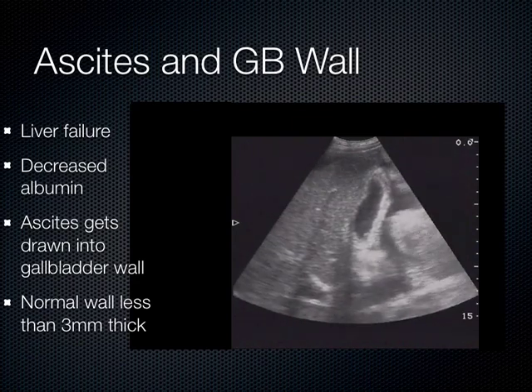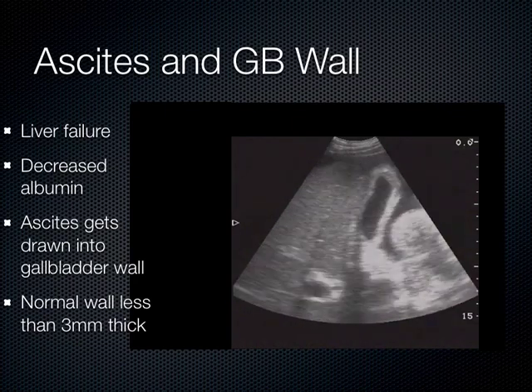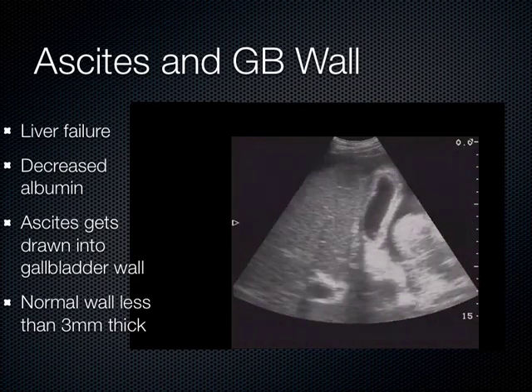So it depends what the models had for lunch. Most of the time, it's almost impossible to eat zero fat. So usually their gallbladders are a little contracted, making them a little bit hard to find.